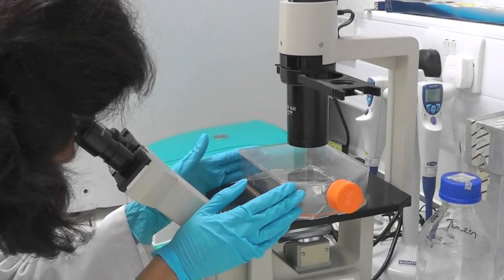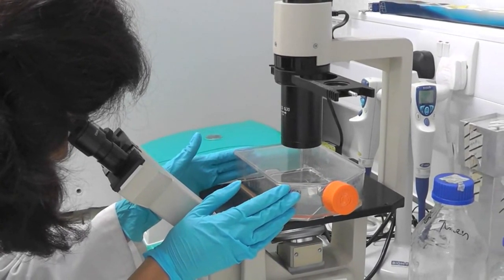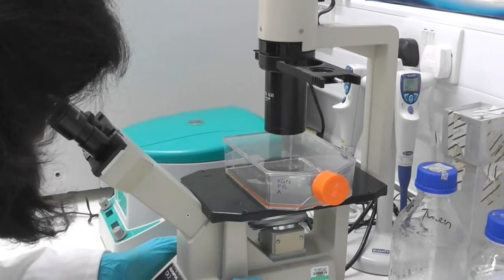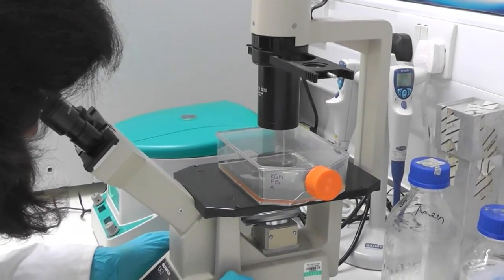Once taken out of the incubator, the cells are examined under a microscope to make sure they are alive and healthy. We also need to identify how confluent the cells are. This term refers to the number of cells in the flask and if they have room to grow. As you can see from this picture, the cells are 100% confluent. This means the cells no longer have room to grow, as all of the surface area is occupied by the cells, and the researcher will need to passage.